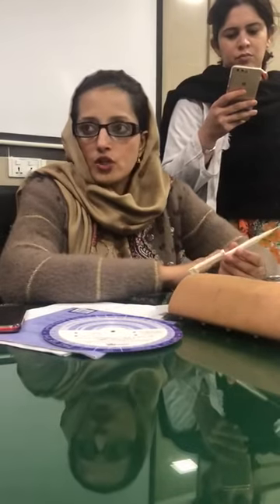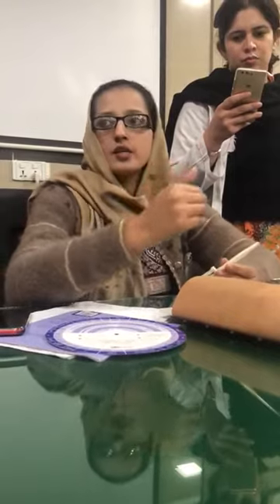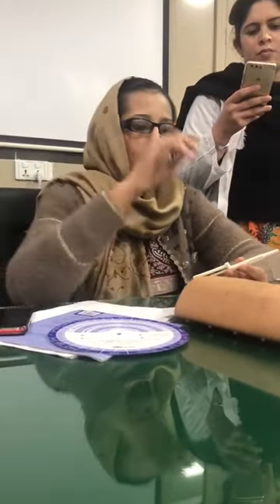The patient will need to wash their arm. Then you have to position the arm outward and rotate it. Ensure proper lighting. Arrange the trolley and all equipment in front of you before starting. You should also have an assistant.